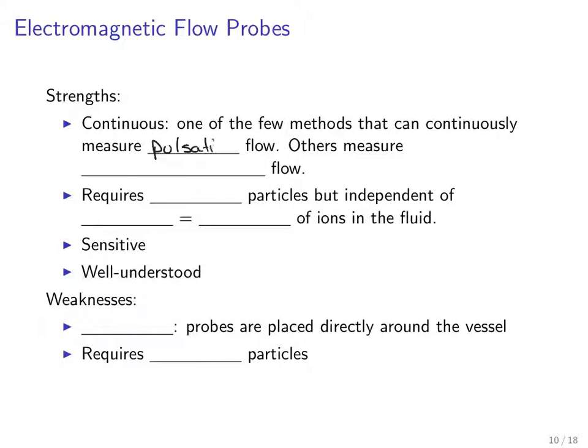Pulsatile flow. Others measure actually time average flow. It does require charged particles, but it's independent of their concentration, or of conductivity, which is equal to the concentration of ions in the flowing fluid.